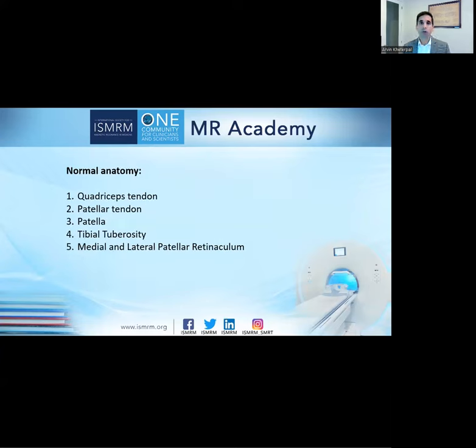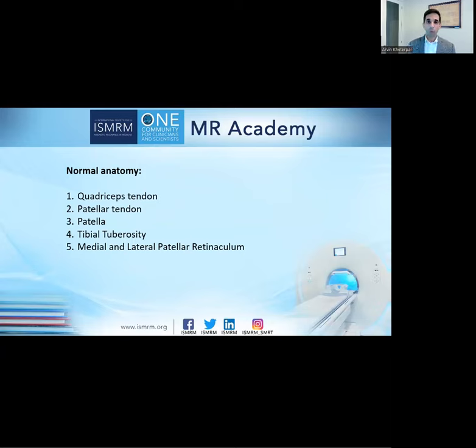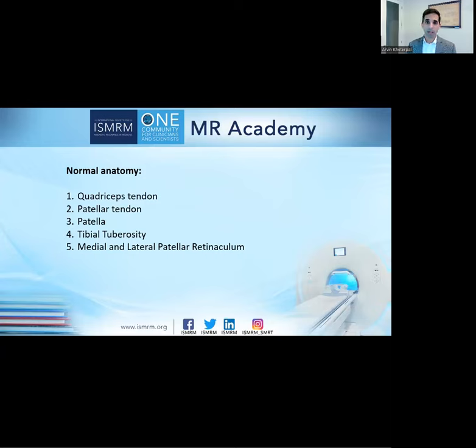So let's talk a little bit about the normal anatomy. What's included in the extensor mechanism? There are five main things you need to know: one, quadriceps tendon; two, patellar tendon; three, the patella itself; four, tibial tuberosity; and five, medial and lateral retinaculum.